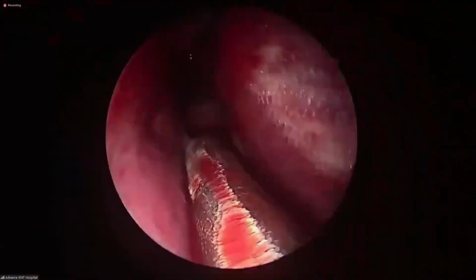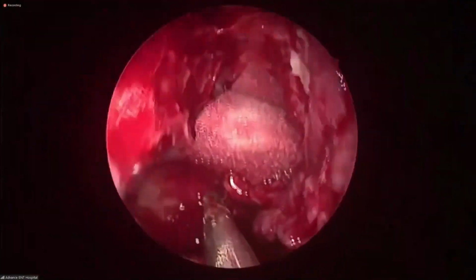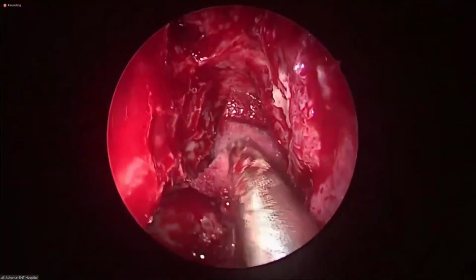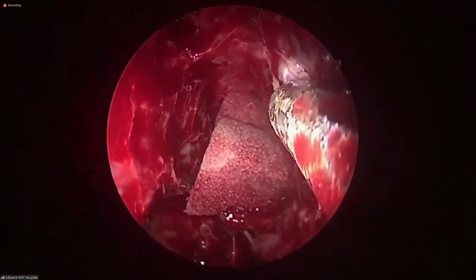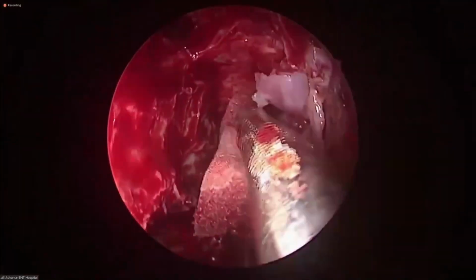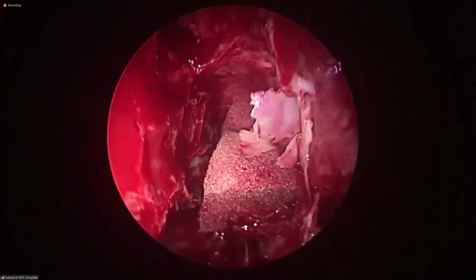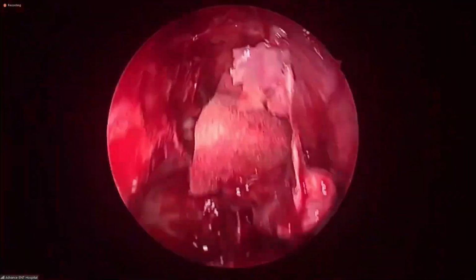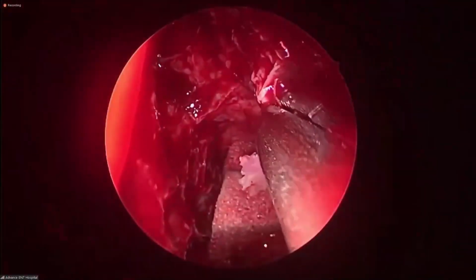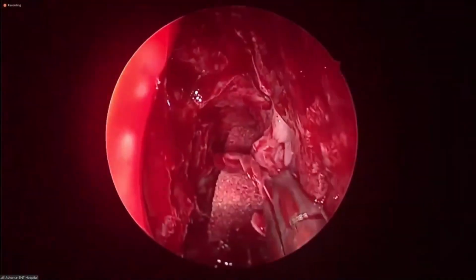All the possible combinations. This is the part of the middle turbinate I left for the end. Yes, sir.